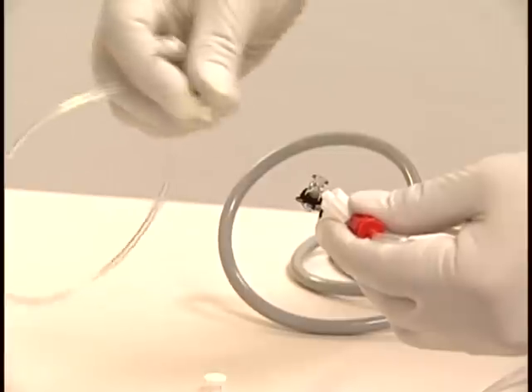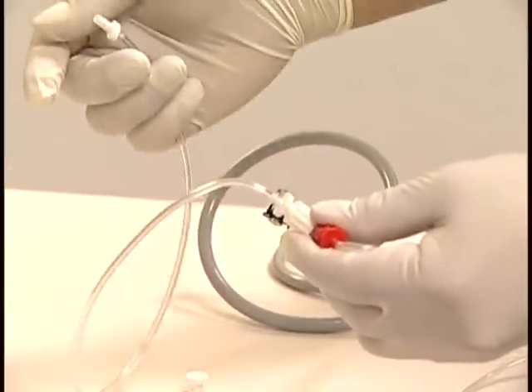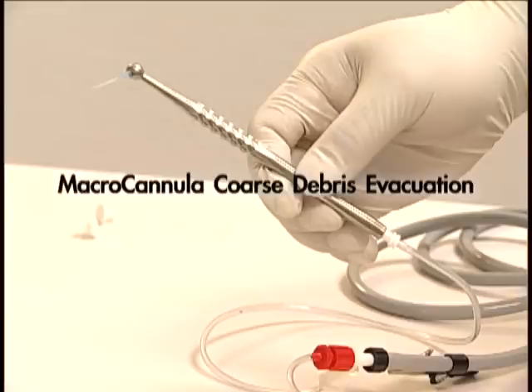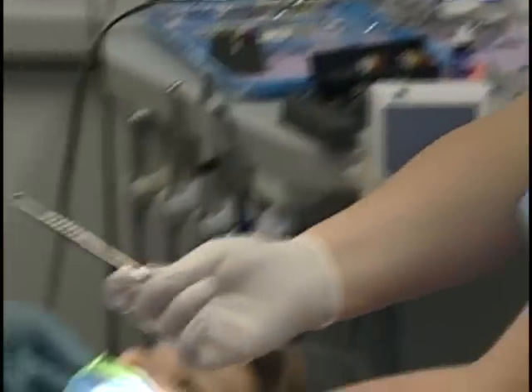At this point, Jennifer has taken the white cap off of the T-connector on the high-vac adapter tube and connected the line with the Endovac handpiece, with the blue macro cannula on it. Here you go. The macro cannula and handpiece are connected to the suction, and we have 5 more 20cc syringes of sodium hypochlorite ready to go, as well as the EDTA and chlorhexidine.